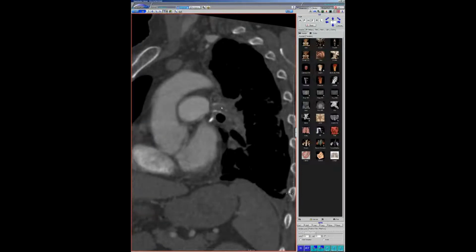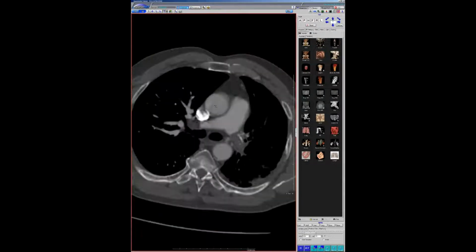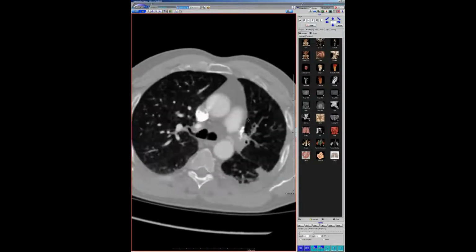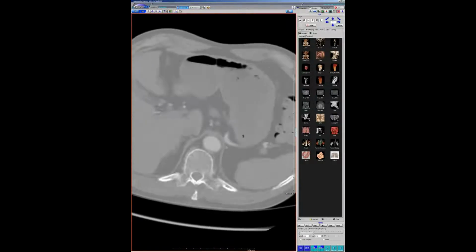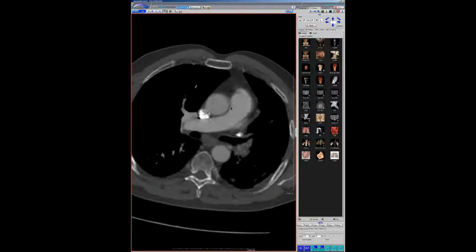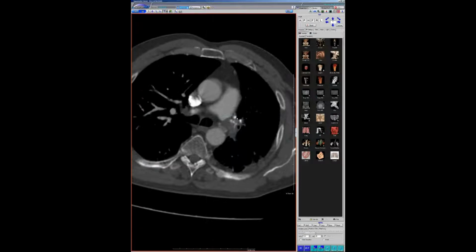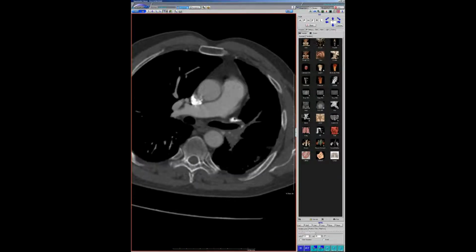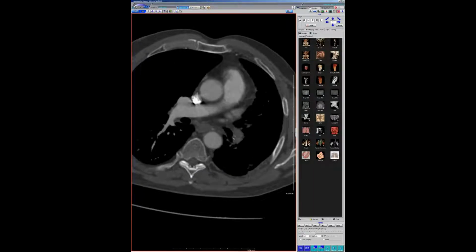It's completely occluded. So, we said, don't bring this guy to UC. And then he has the granulomatous calcifications on the left lung. He has some granulomas in the spleen. So we're like, don't bring this guy for surgery because outcomes are bad if you do an endarterectomy on someone with fibrosing mediastinitis.